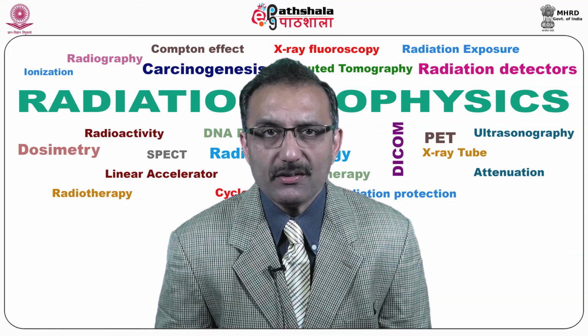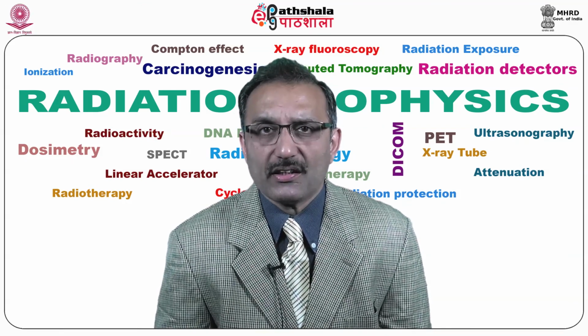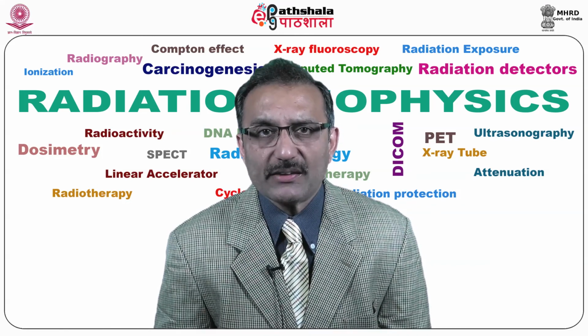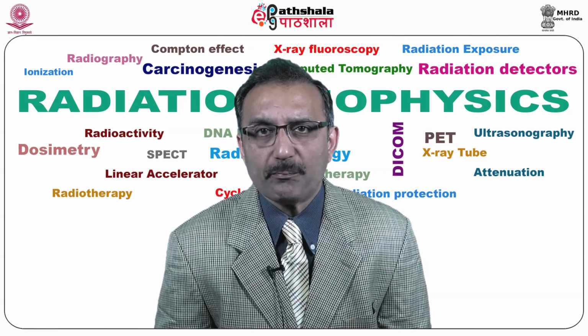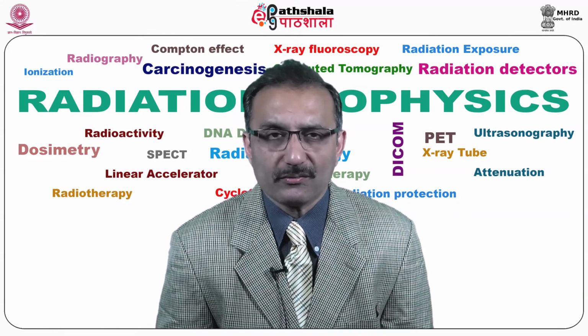PET imaging has been shown to improve detection of a variety of cancers, and other tests have suggested this technique may be useful in identifying small tumors in patients with paraneoplastic neurological disorders.